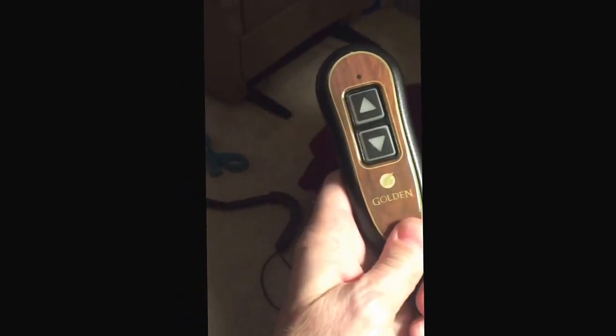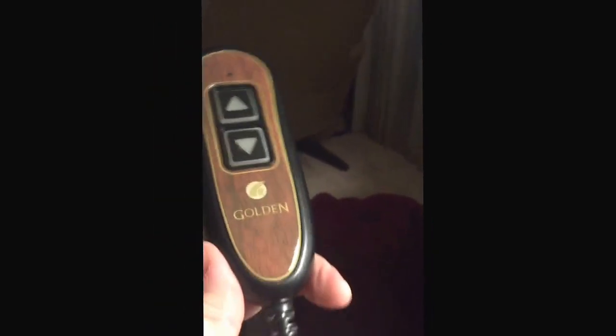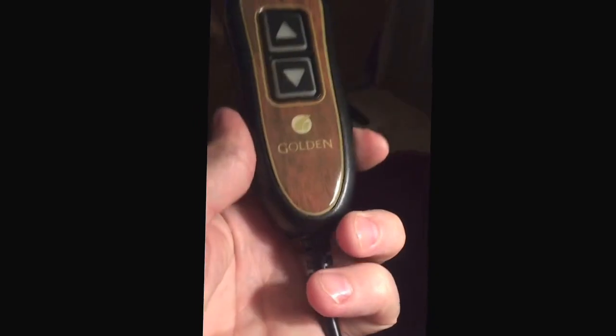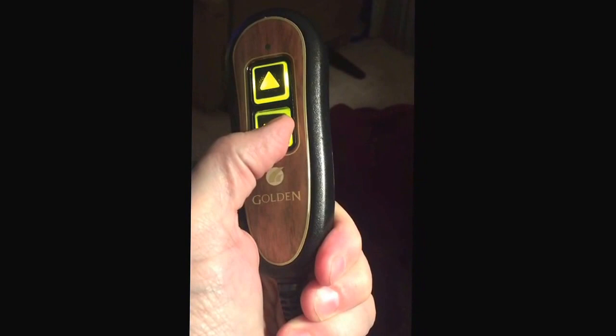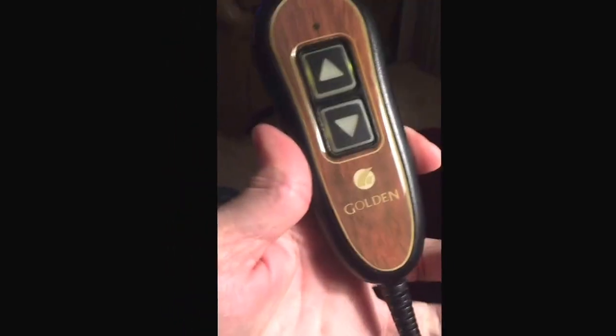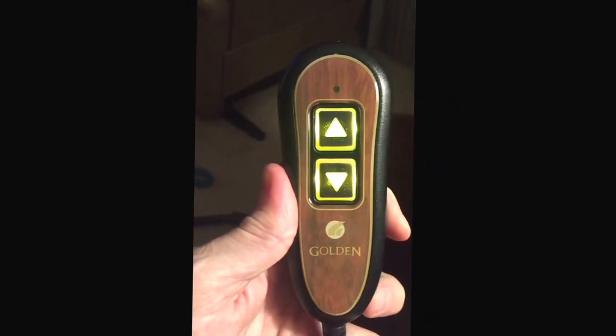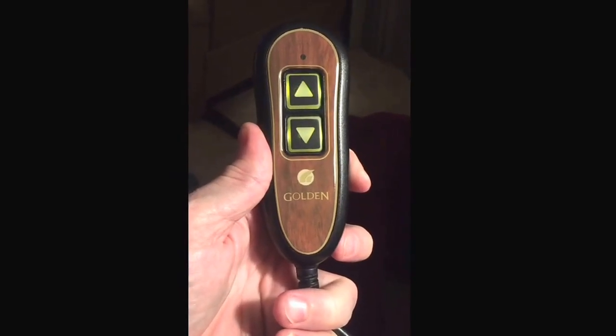What we found here, this is my mother-in-law's chair, is that the remote seems to lose power every now and then, and the only way to get it to work is to push the bottom, and there it goes. Push the bottom in and then it'll work in the up or down as long as you hold it in there. So let's do it again. All right, see, you got to push the bottom into the remote. So I'm going to take it apart and see what we find.